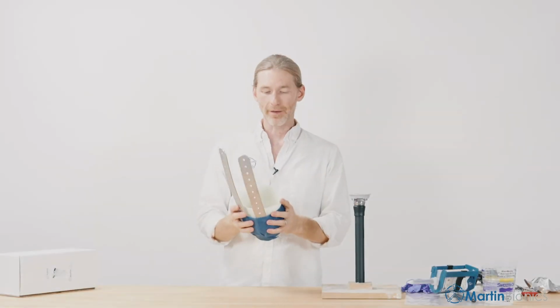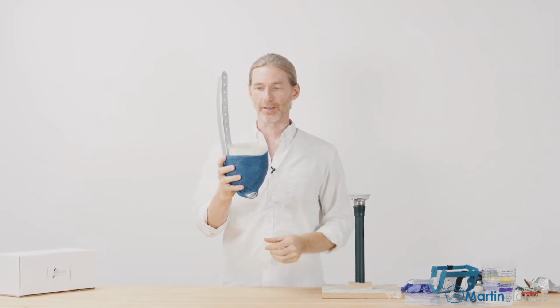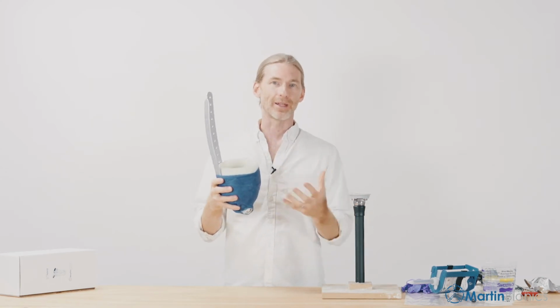All right, so now that we have the cast taken, we have our frame, the blue section, our flexible inner socket, the white section, and we have our 2 lateral struts anchored in place. We're going to beef this up so it's ready to really walk on.